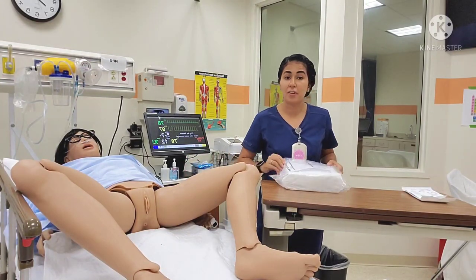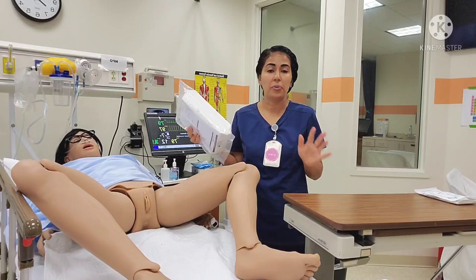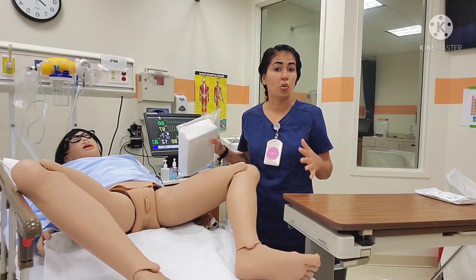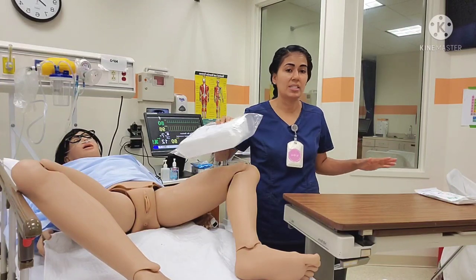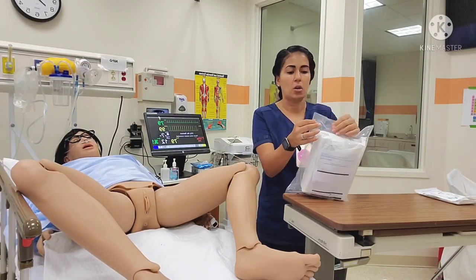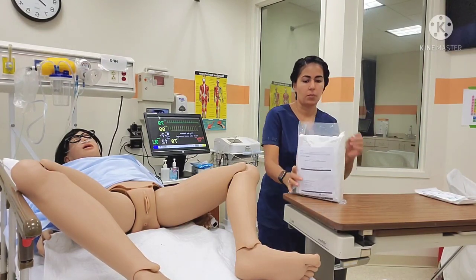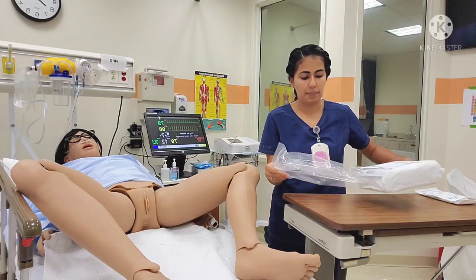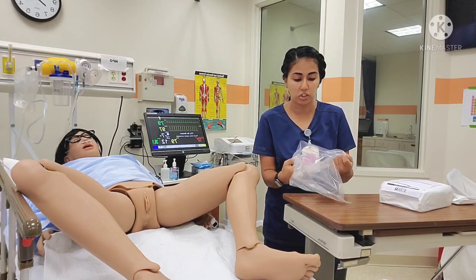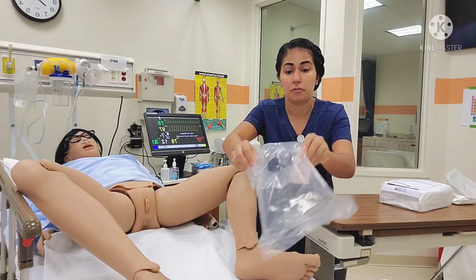I cleaned the patient using the peri wipes — for the purpose of the video I did not go through that in detail. What I always tell my students is that this is your work area, like your home office. You really want to set things up to be comfortable, so think about where you're putting things. There's a perforated line here on the kit. I'm going to take my kit out and keep the bag as an extra garbage, and I put this at the foot of the bed.